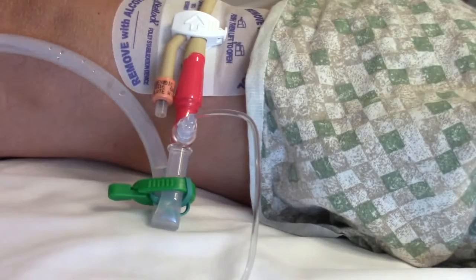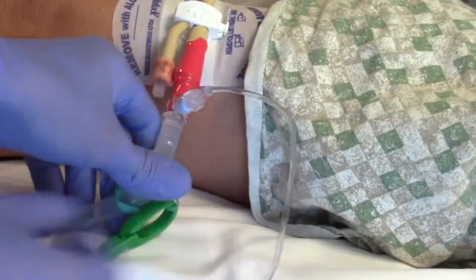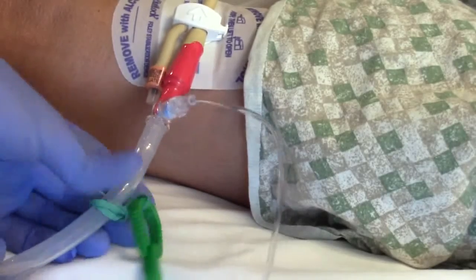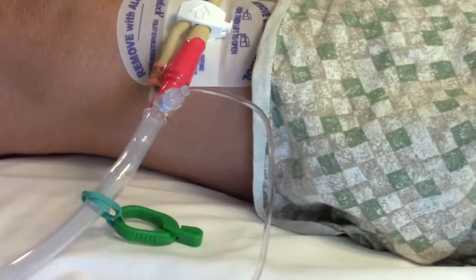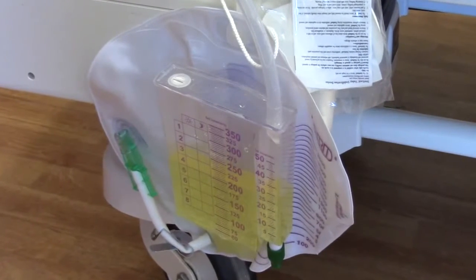At end expiration, mark the pressure reading on the monitor. After you've taken measurements, unclamp the urinary catheter tubing to allow drainage to continue. You may leave the transducer setup connected to the catheter if serial measurements are ordered, and remember to subtract 25 milliliters from the patient's urine output.